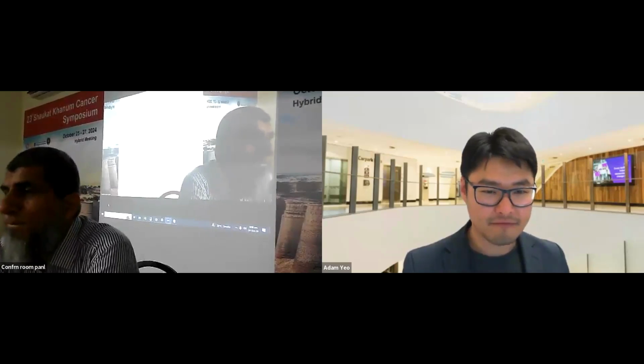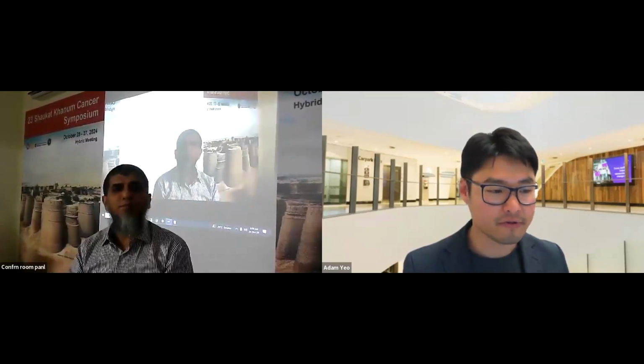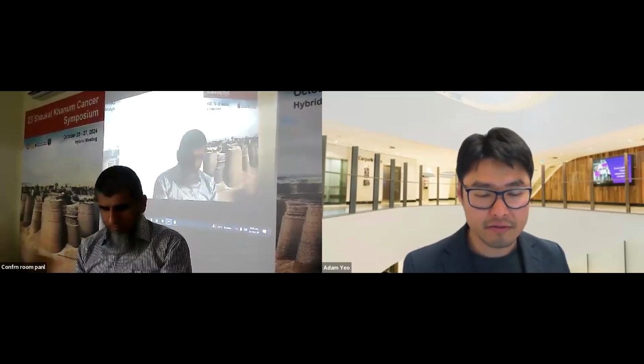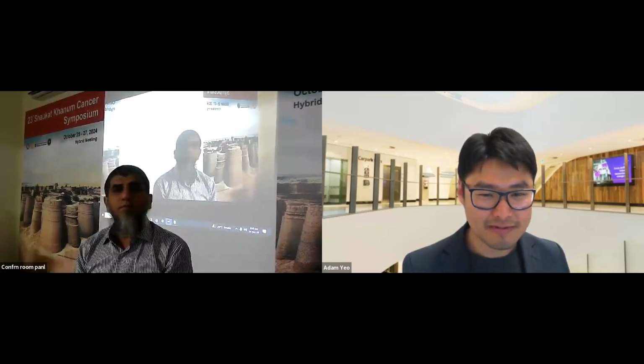So CyberKnife, if you have it in your toolbox, is an excellent tool. I'm not an expert; I had only fellowship experience with CyberKnife, but our neighboring site does have it. It has certain advantages dosimetrically, and it has the tumor tracking option. It's good for SABR. But everyone's aware that in busy centers with large patient volumes, it takes a long time.